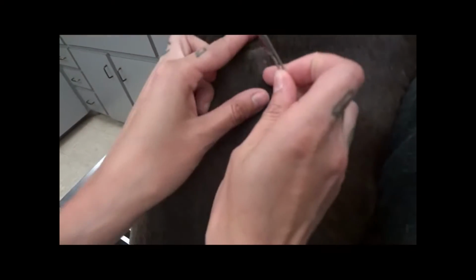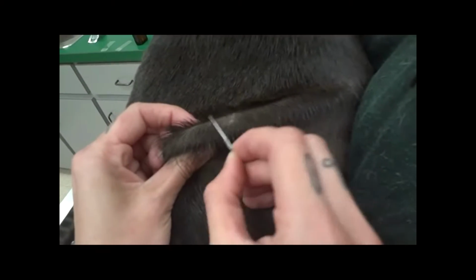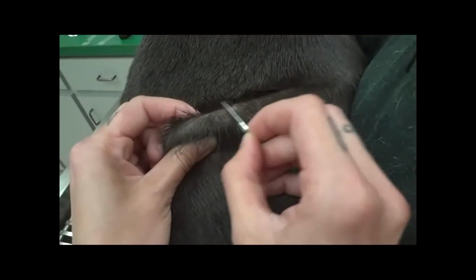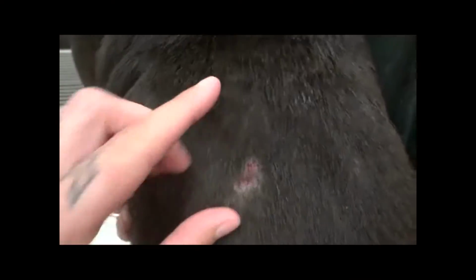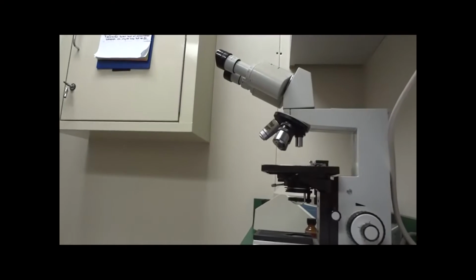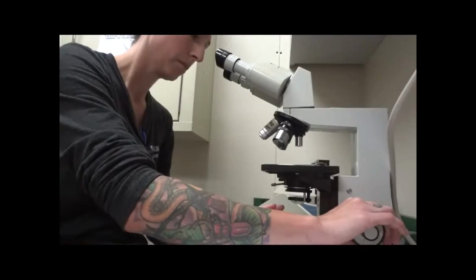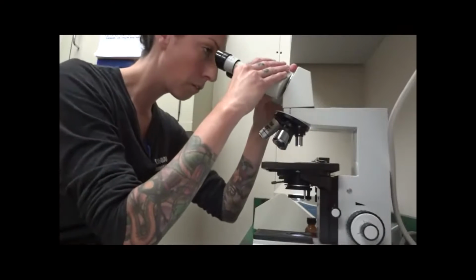That's good. Looking for a part of the hair that is showing the most alopecia. And start scraping against the hair follicle until we start to see it bleed. Alright, that's what it looks like afterwards. And we've taken the scalpel blade and put it in the mineral oil, and we'll look at it under the microscope. Alright, we're going to be looking at our skin scraping on the microscope, on 4 power.